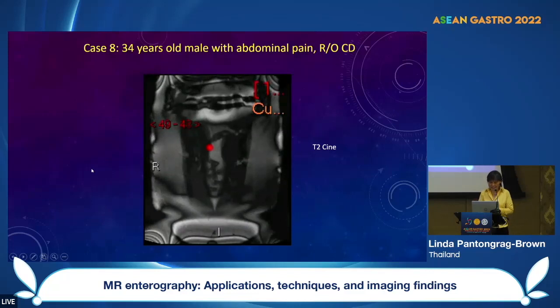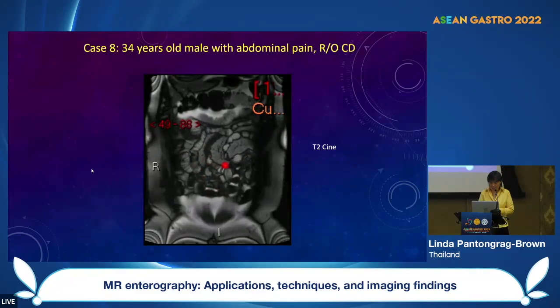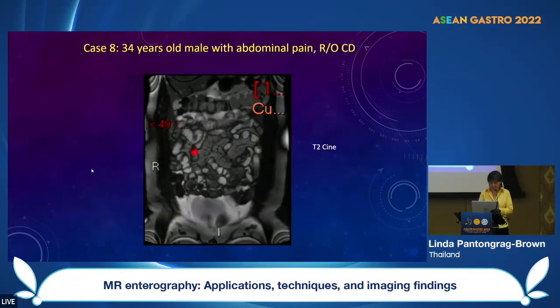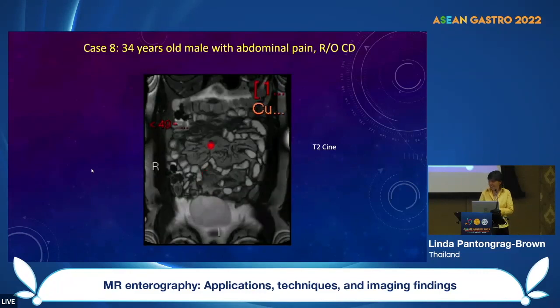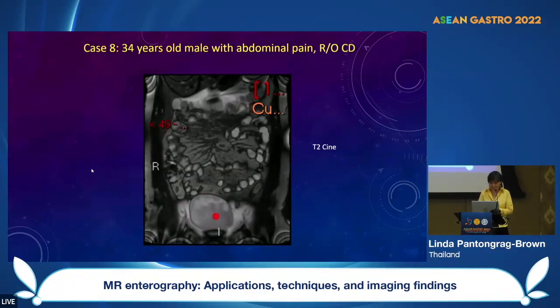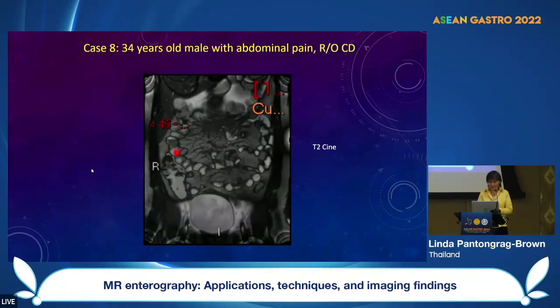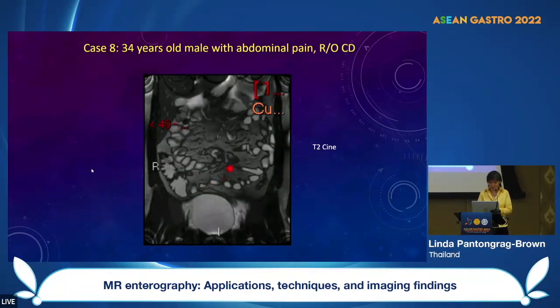You can see here that there is normal peristalsis of the small bowel. I want you to focus around the left mid-abdomen. So you can see here that there's a dancing of the peristalsis, and even the bladder, you can see the movement. Everything is moving, so they have life inside your abdomen. They keep moving alive, but look around here.